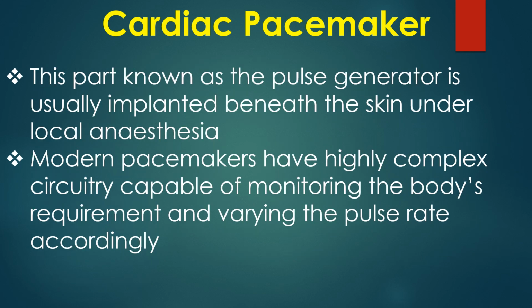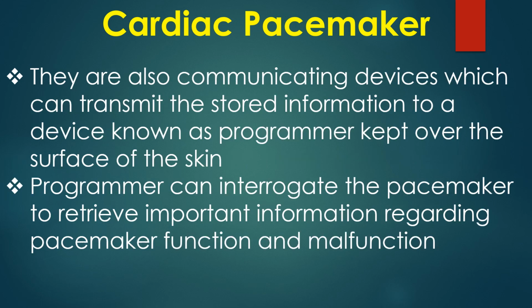This part, known as the pulse generator, is usually implanted beneath the skin under local anesthesia. Modern pacemakers have highly complex circuitry capable of monitoring the body's requirement and varying the pulse rate accordingly. They are also communicating devices which can transmit the stored information to a device known as programmer kept over the surface of the skin. Programmer can interrogate the pacemaker to retrieve important information regarding pacemaker function and malfunction.